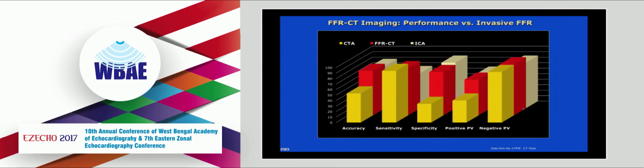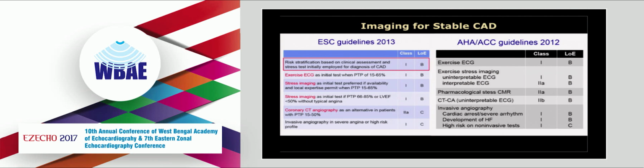And if you take one message from this talk, it is CT is good for ruling out coronary artery disease, but not so good for ruling in coronary artery disease. That's improving, that's changing, but at this stage, its negative rule out power is bigger than its positive rule out. And that's why it's often recommended for low risk individuals to rule out coronary artery disease.